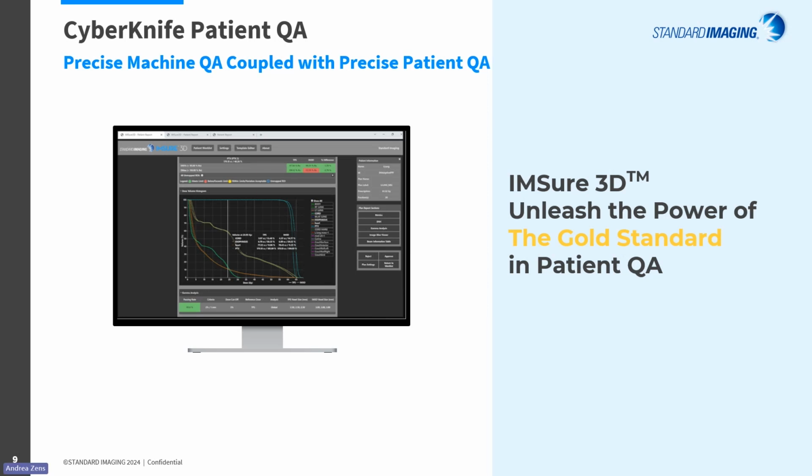Patient-specific pretreatment QA measurements partially solve this issue. However, they tend to require specialized hardware and software. They greatly increase physics time, and we all know physicists don't have extra time, and they can create challenges relating to QA impact of dose discrepancies to actual patient dose distribution.